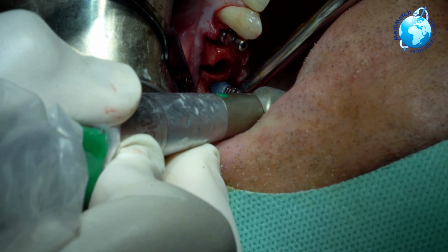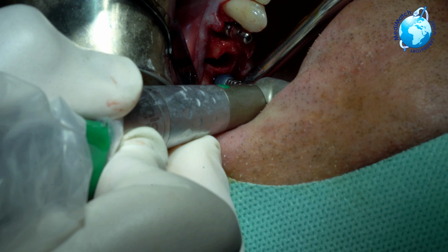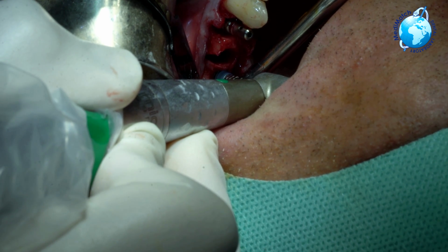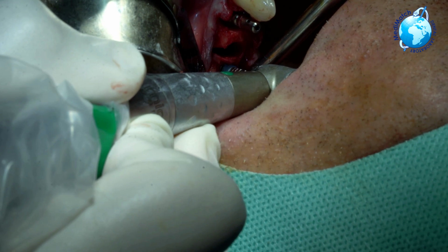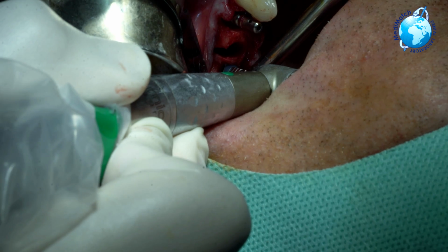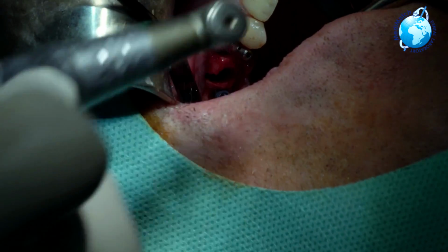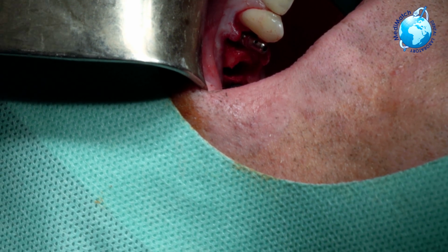37, 44, 48, 49, 51, 52, 61, 60, 61, 62. So you're getting these sort of torque figures off, and we're maxed out at 70. Okay, so when it maxes out at 70, you can hit 100. With this particular implant, it doesn't matter. And I'm going to show you how to now relax it to get that last few mil of where you want that implant to be.